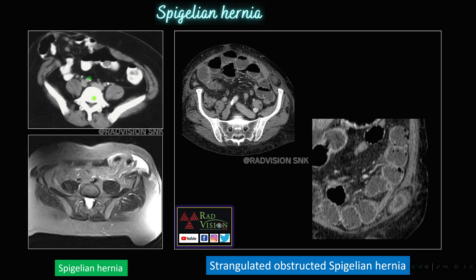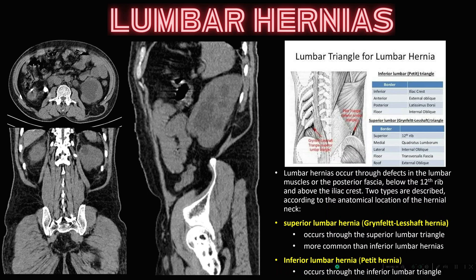Next, spigelian hernias — you already know this is herniation of bowel loops through the spigelian fascia, between the rectus abdominis and transverse abdominis muscle. This is spigelian hernia on the right side, this is spigelian hernia on the left side on MRI. Here also you can see spigelian hernia on the left side, but with abnormal enhancement and adjacent fat stranding with dilated bowel loops inside — this was a case of strangulated obstructed spigelian hernia.